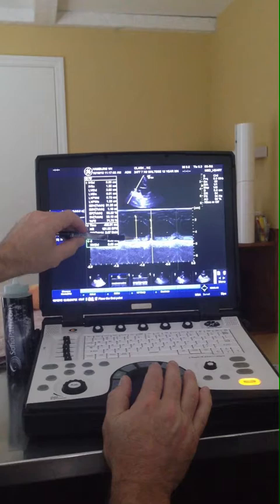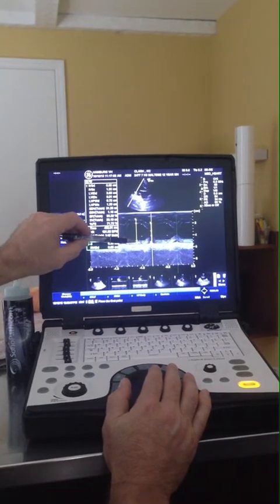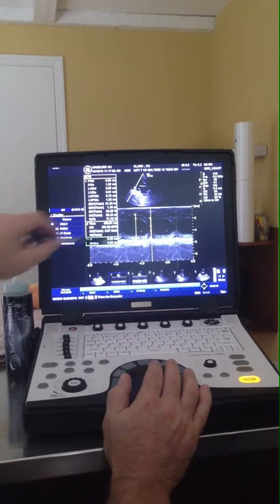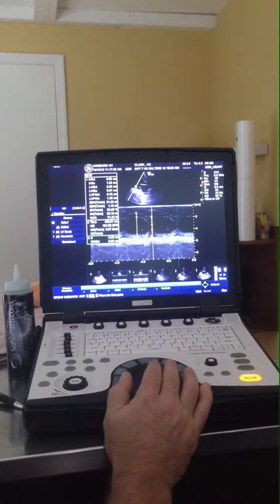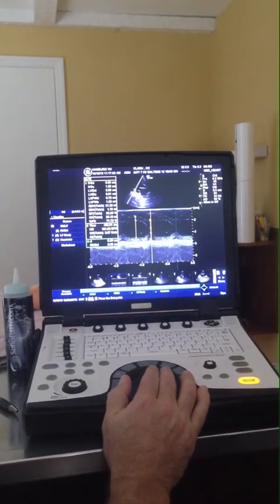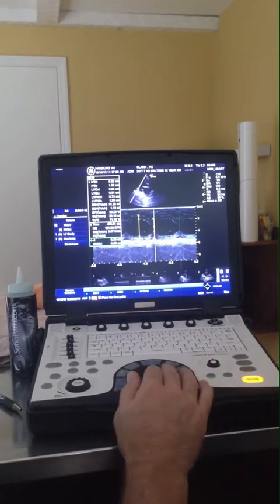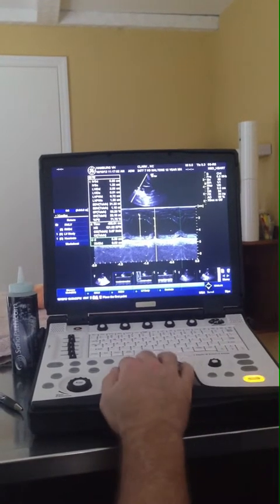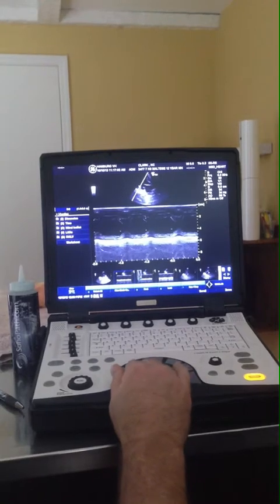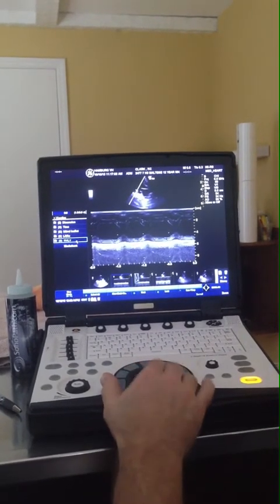Looking at it, it's like maybe I gave the free wall too much here — maybe this is a little bit of papillary or something. We may keep that or we may redo it. We'll save that one, clear it, and maybe take another contraction — I'll scroll back and do it again.